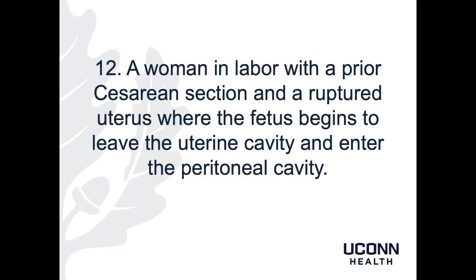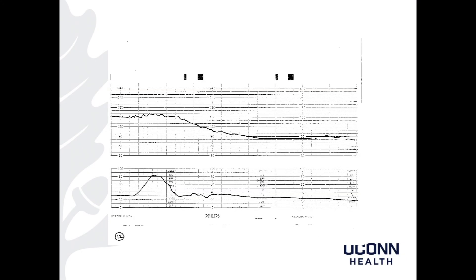Patient 12, our last case, is a woman in labor with a prior cesarean section and a ruptured uterus where the fetus begins to leave the uterine cavity and enter the peritoneal cavity. My read: baseline of 150s with eventually minimal variability, accelerations absent, and a prolonged deceleration. As the baby makes its way into the abdomen, it's completely not getting any oxygen. You can see off to the far right of the tracing that the heart rate is beginning to not be picked up. This is an absolute emergency in the setting of a ruptured uterus.